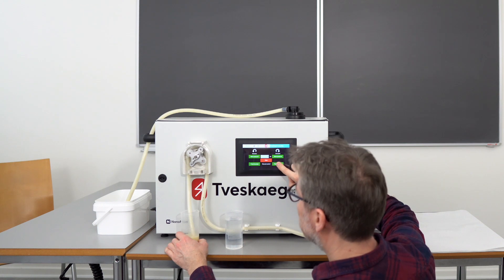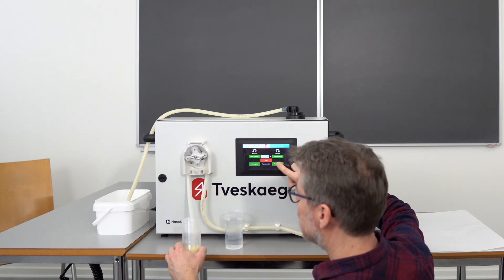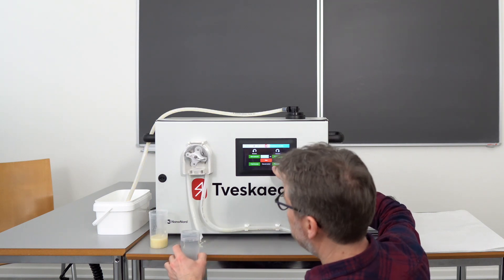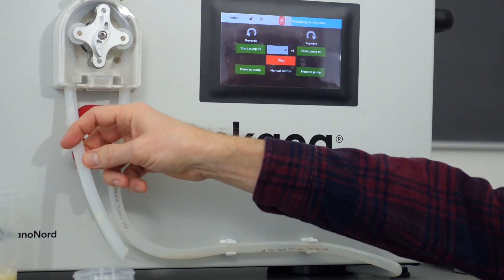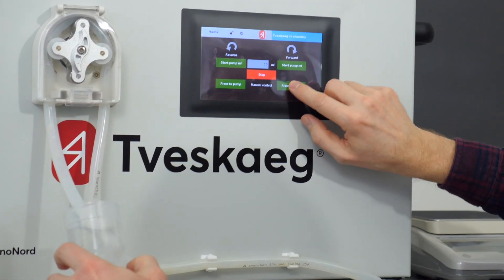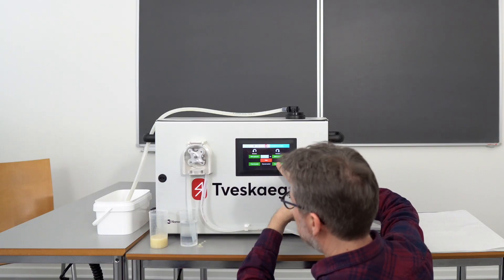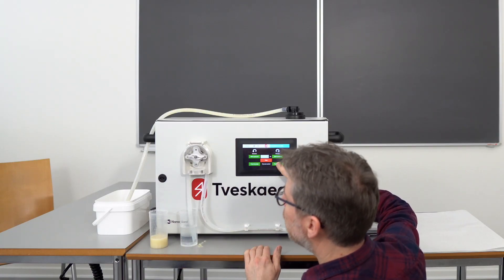So I press here, and you can see it empties the system of stuff now — a little bit messy down here — and I will just continue with the water now, so the water basically flushes out all the stuff that's inside the tubing.